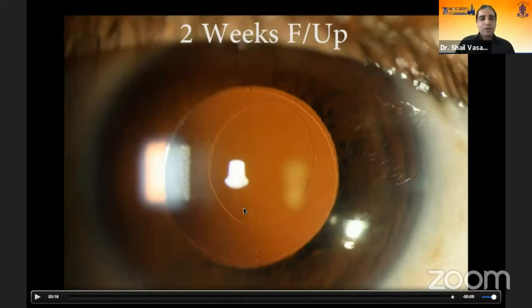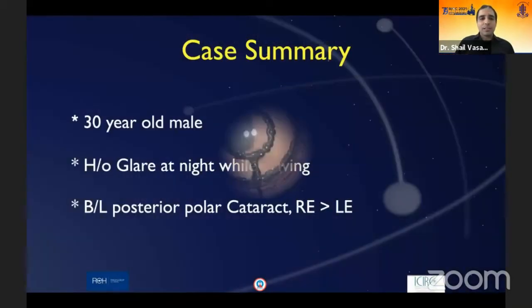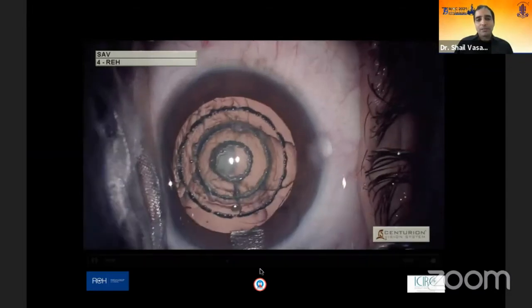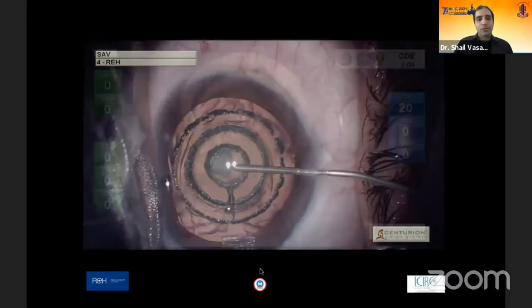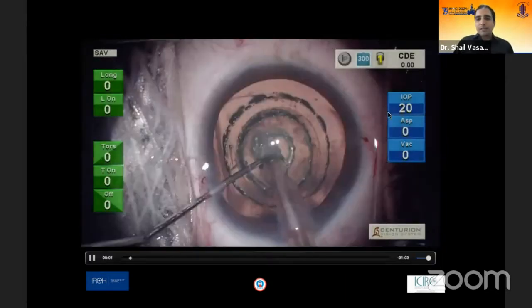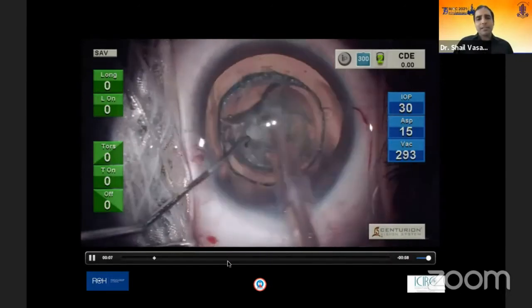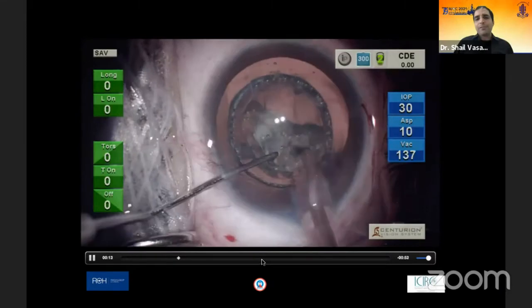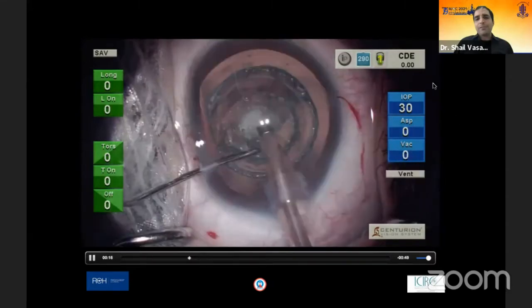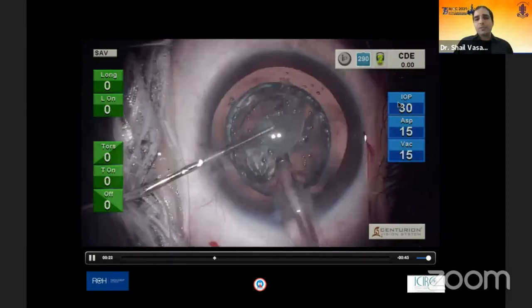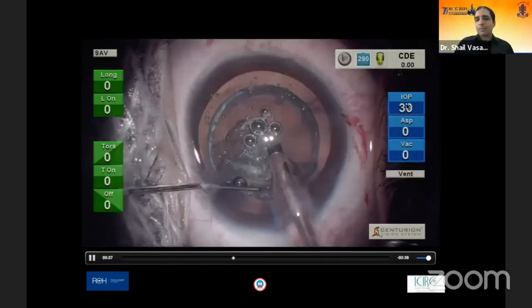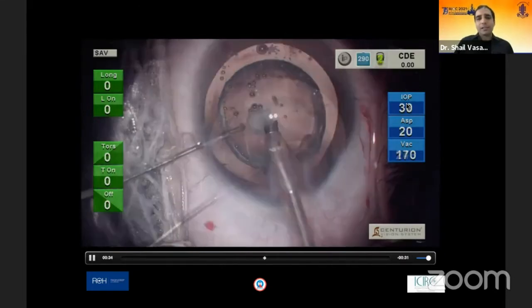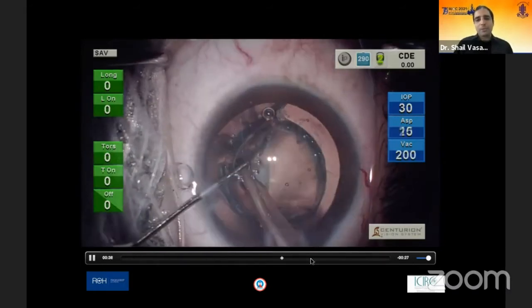Maintaining contours and femtodelineation really helps in such situations. Another similar case: a young posterior polar cataract patient who had never experienced presbyopia. We counseled that if everything goes as planned, we may consider a multifocal trifocal toric IOL. We apply the same principle — start with low IOP and low flow rate, working at approximately 45 to 50 bottle height, reducing anterior chamber turbulences to protect the weak posterior capsule area.